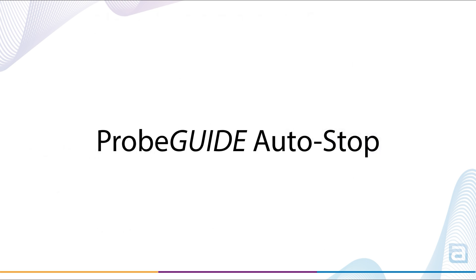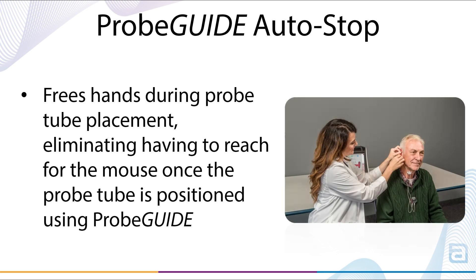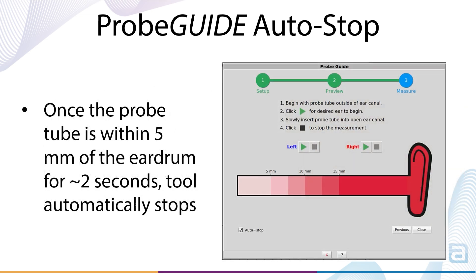ProbeGuide AutoStop: To simplify probe tube placement and free up the clinician's hands, ProbeGuide can now be set to AutoStop. Once ProbeGuide determines the probe tube is within 5mm of the eardrum, the tool will stop without the need to use the mouse. By default, AutoStop is checked. Simply uncheck the box if you prefer to manually stop ProbeGuide by clicking the Stop button.